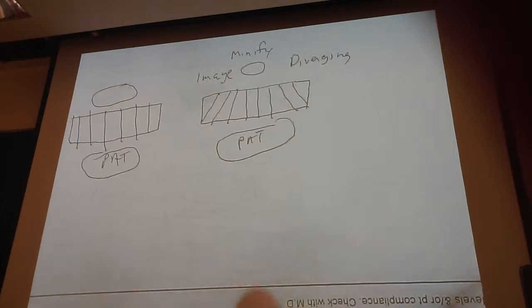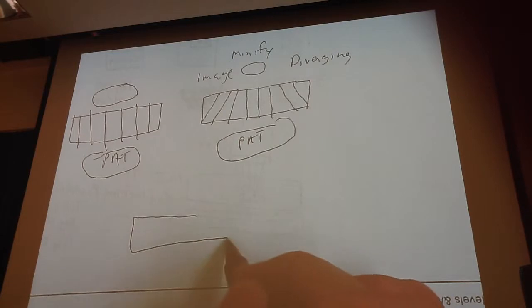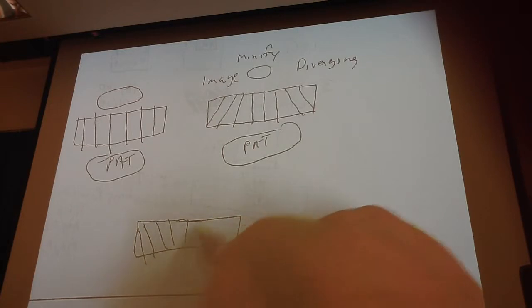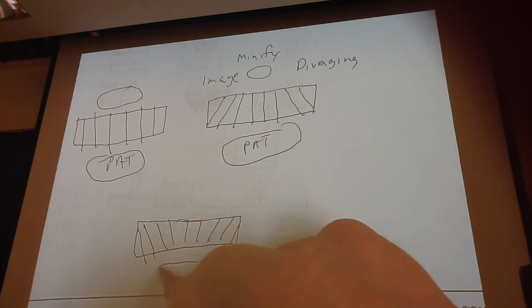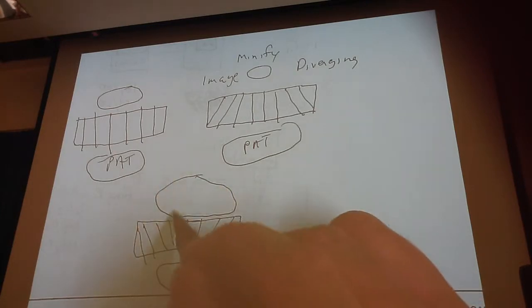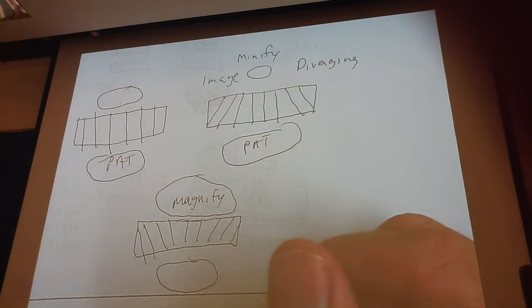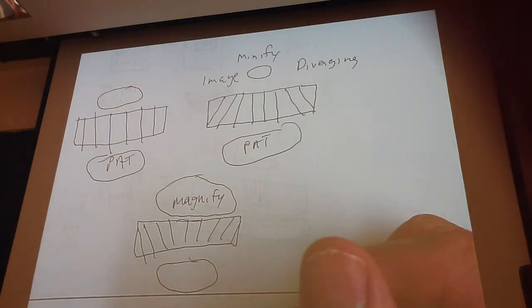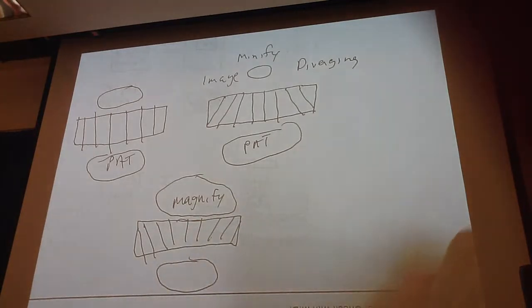Now some of you may have a converging collimator. On a converging, the septa kind of point in, so this magnifies the image. If you have one of these, you'd probably use it when you're doing like a neck for a parathyroid or something like that. Some people use the computer to electronically magnify it, but if you have a converging collimator, then you can actually magnify it with that.